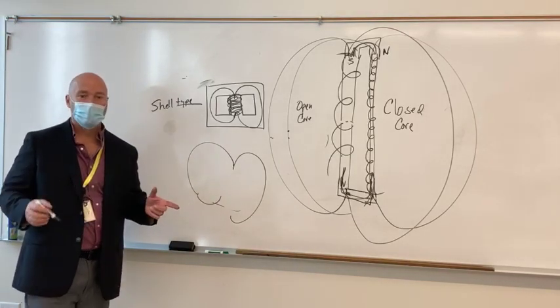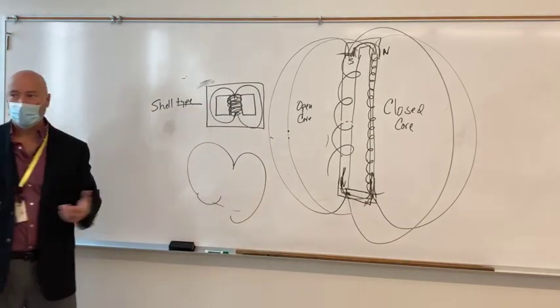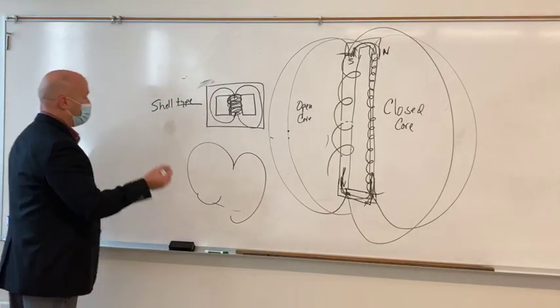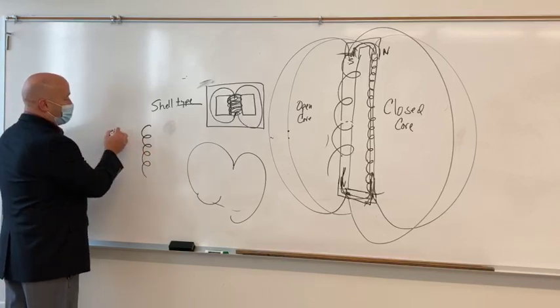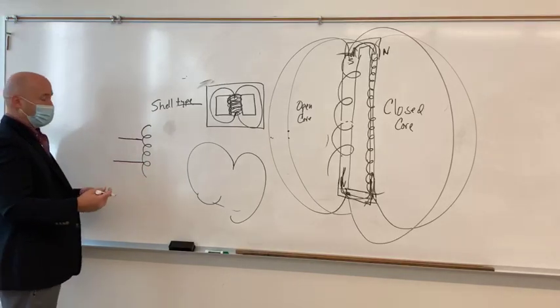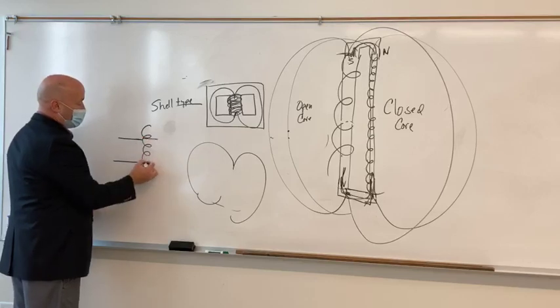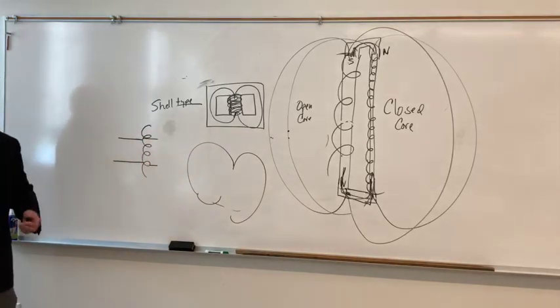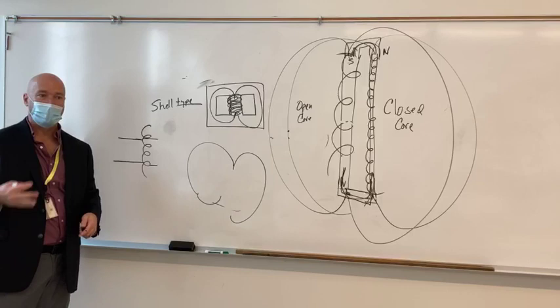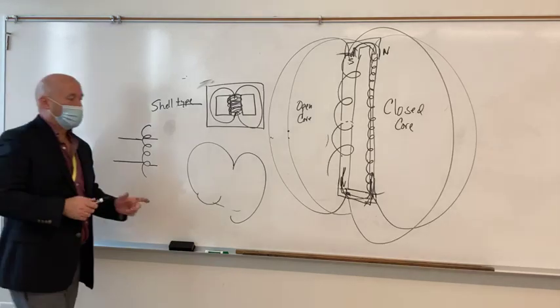Some of the power is going to go into just creating that mechanical energy. And since there's no moving parts here, they may be 99.5% efficient, very, very efficient. But they're still not totally efficient. So back to our auto transformer, this is not on the test, it's just bonus material. What you may have is contacts on the primary side with contacts on the secondary side, spread out just a smidge to compensate for the loss due to those three things: the eddy currents, the hysteresis, the resistance in the wire.